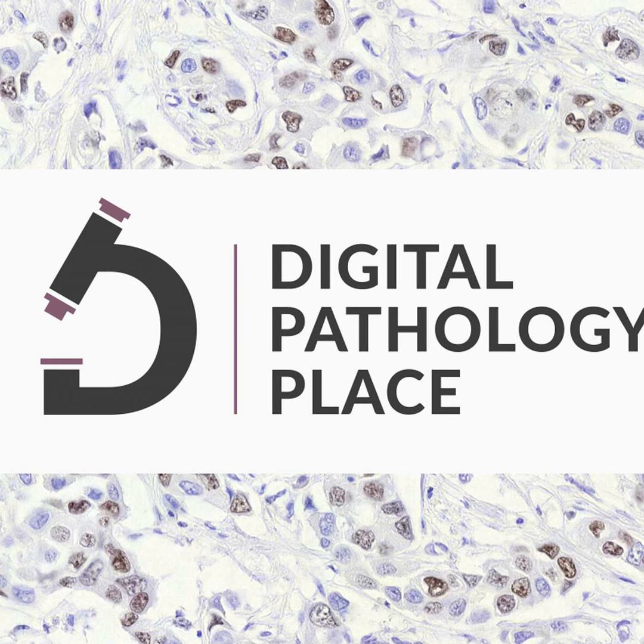So there is a little part from each side regarding the basic knowledge, but then the main part of this bridge is the communication. And actually, even the FDA is recommending that in the AI pipeline you need to have this kind of quality review. And who is the person that can do the quality review in pathology? It's the pathologist. The only person who is qualified to check whether it recognizes a cancer or not.